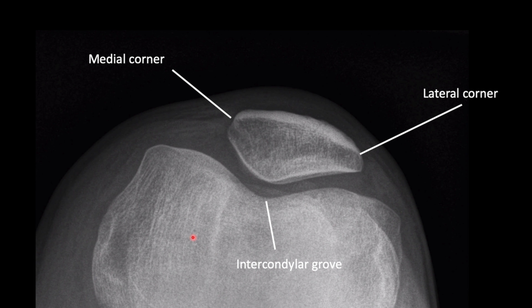This is the skyline view. The lateral corner and the medial corner, and the patella sits in the intercondylar groove. You can see how the lateral corner is more elongated and doesn't have much bulk of bone from the distal femoral condyle. Therefore, a lateral patella dislocation is more likely to happen than a medial patella dislocation.